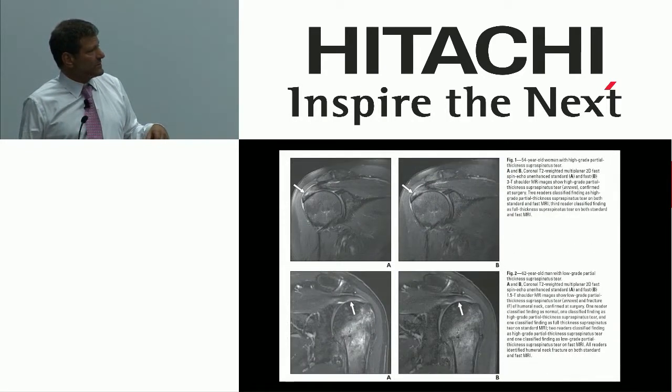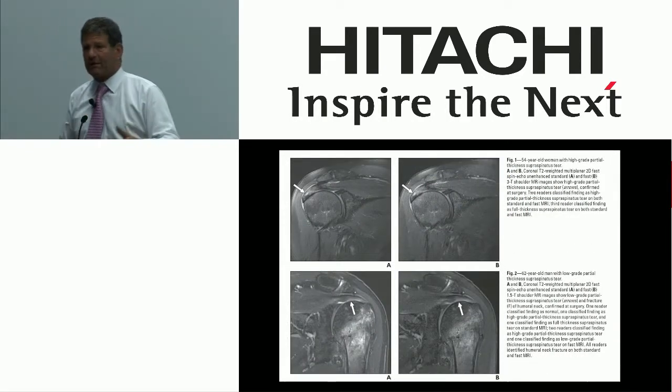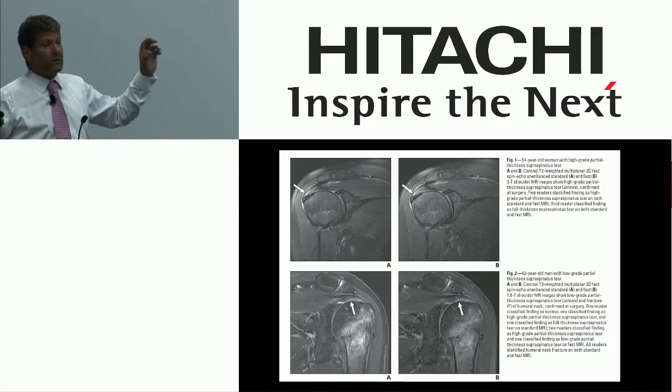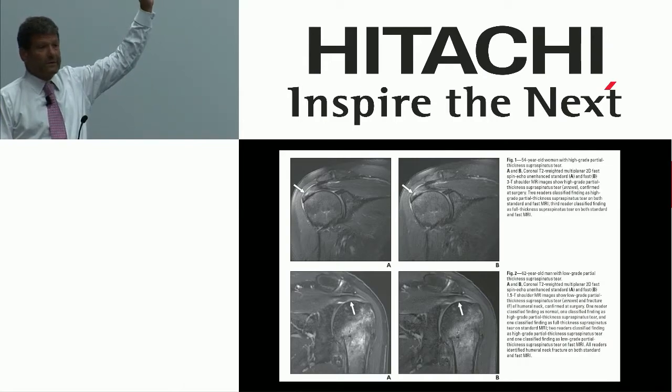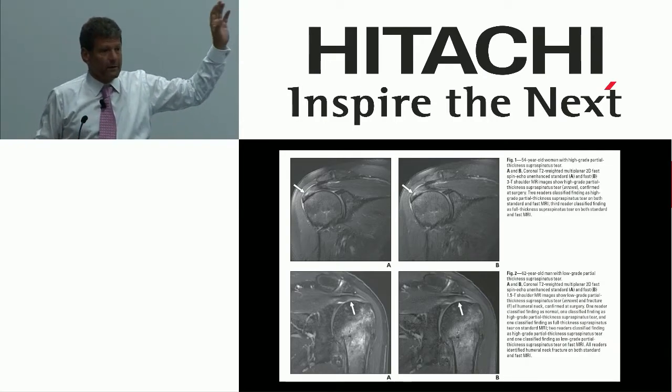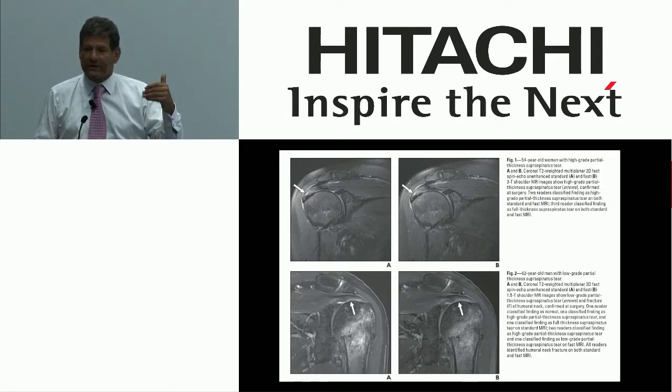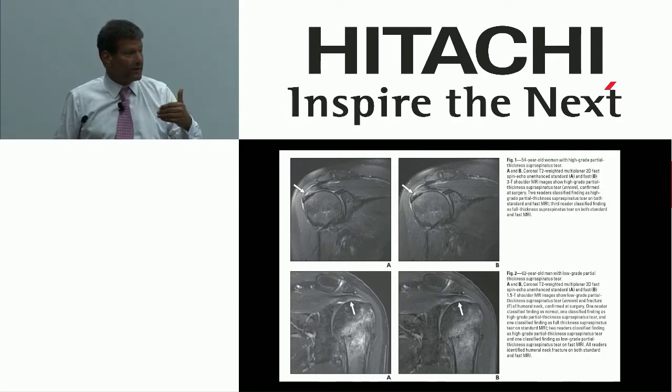I forget where this was presented, but they showed, look, we go ahead and use parallel imaging, we accelerate, we make an exam that's less pretty, right? Who's been told if our exams aren't pretty, we're going to go down in flames, okay? Less pretty. No effect on outcome. And again, patients off the table so fast, they give you the most spectacular ratings, and I'll prove that to you as we go along.